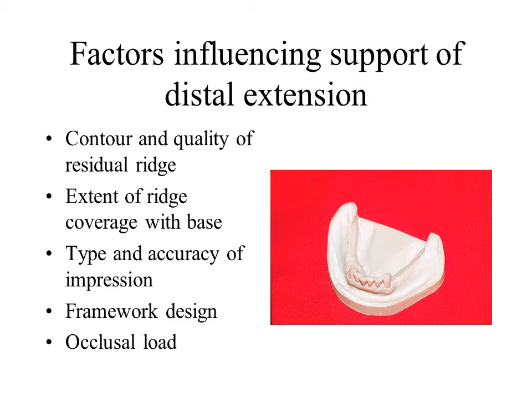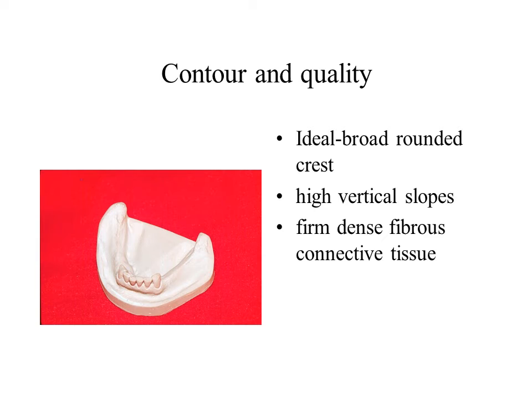A combination of factors influences the support provided by the residual ridge. Several of these factors are listed. These factors may be controlled by the dentist to varying degrees. Ideally, the ridge would consist of a broad rounded crest, high vertical walls, cortical bone and dense fibrous tissue. This is not often the case.